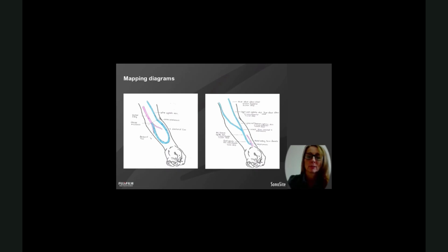I would identify if there were any narrowings and what their diameter were. I've noted the diameter of the vessel. It's not quite the diameter we would like, so we'd keep monitoring that. And I've noted the depths as well, and that there is actually a branch in the mid-forearm, and how far above the elbow crease that is, particularly in the deeper vessels. If you can't palpate it, sometimes people will palpate just before it branches. It will feel nice and wide, but they won't realise that it's actually branching left or right, and then when they thread it, they actually have an infiltration.